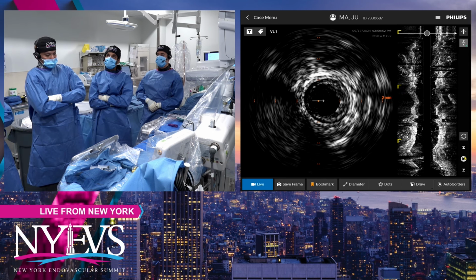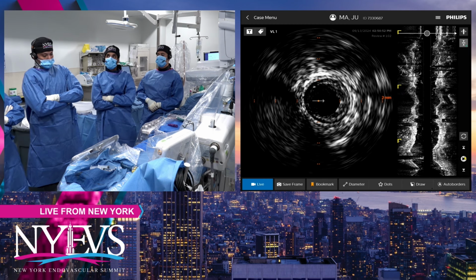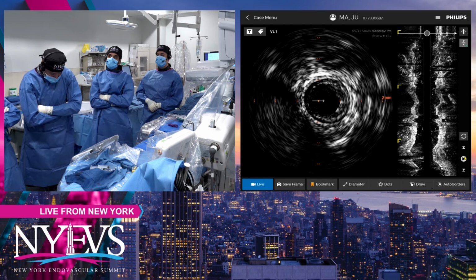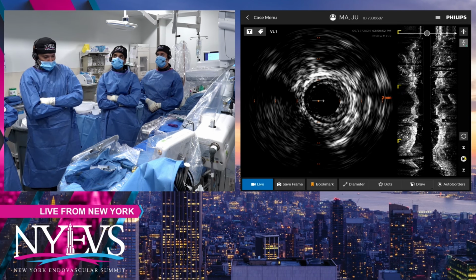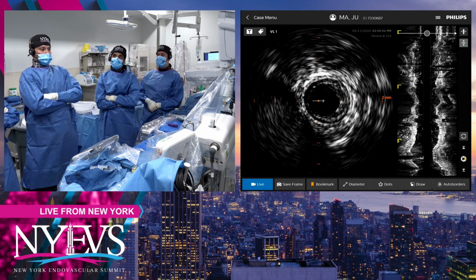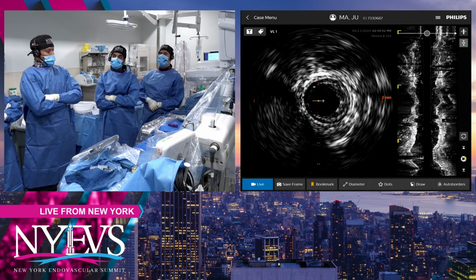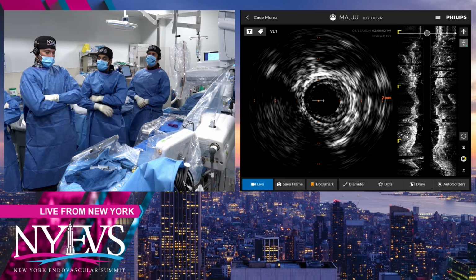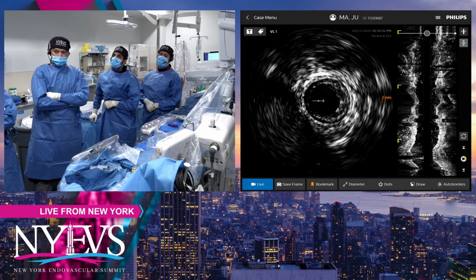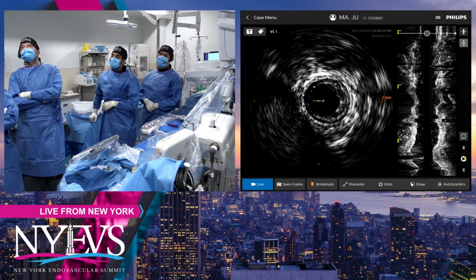If you would do laser, of course, I would use a filter, because sometimes if you are going too fast, you're pushing the thrombus away. But with Rotarex, you successfully remove all clot material, usually. And Thomas, is this because you're only using the Rotarex for Tosaka 3? In a diffuse in-stent restenosis, you won't use the Rotarex, or you would still use it?